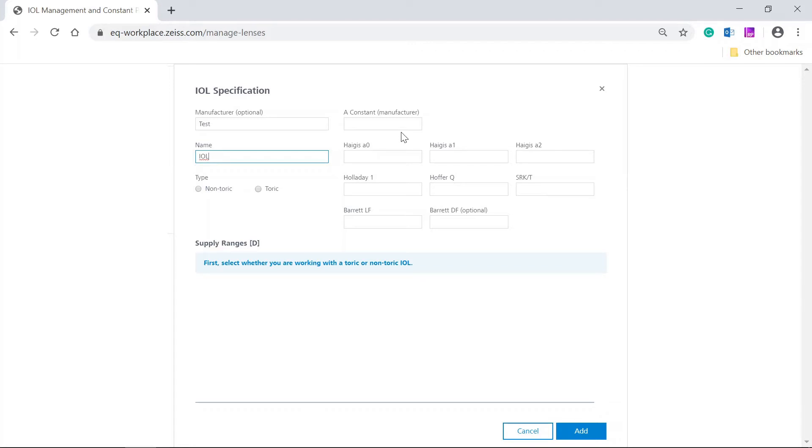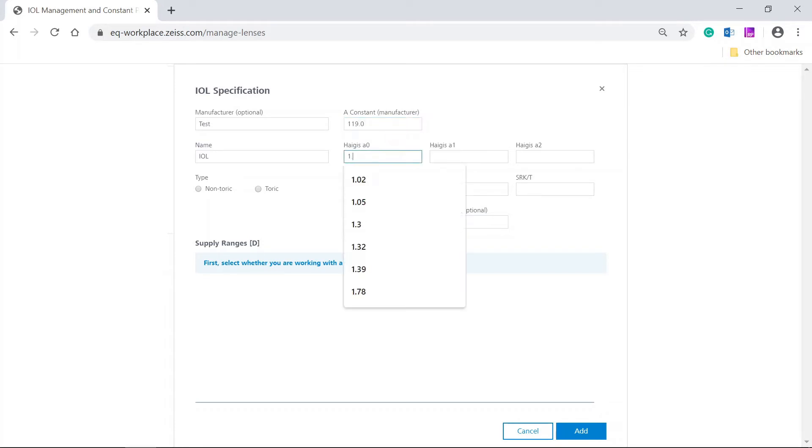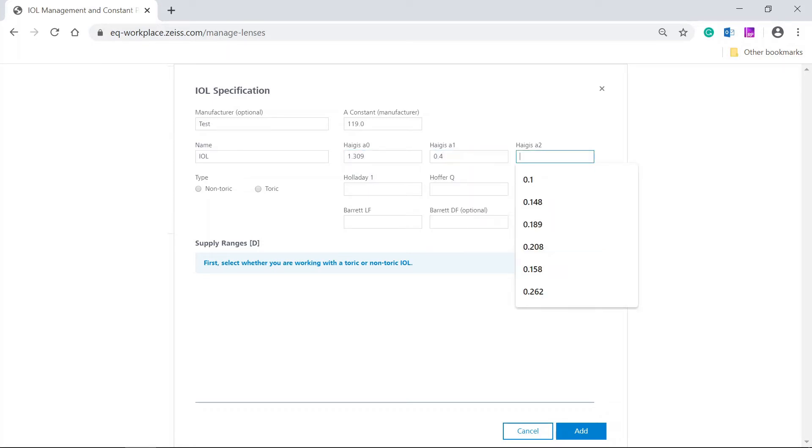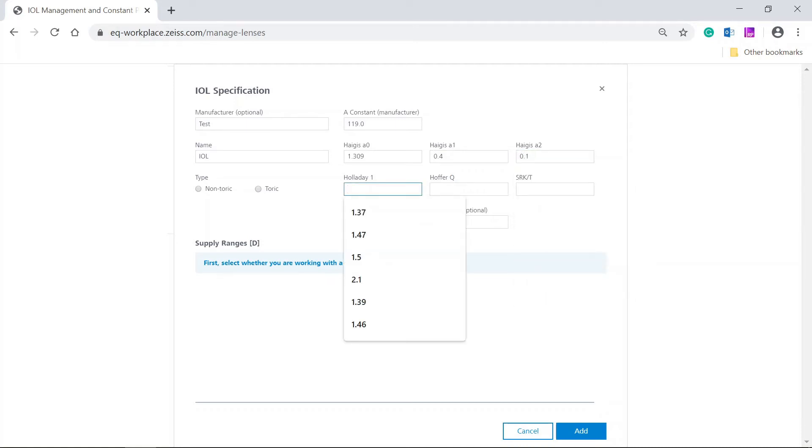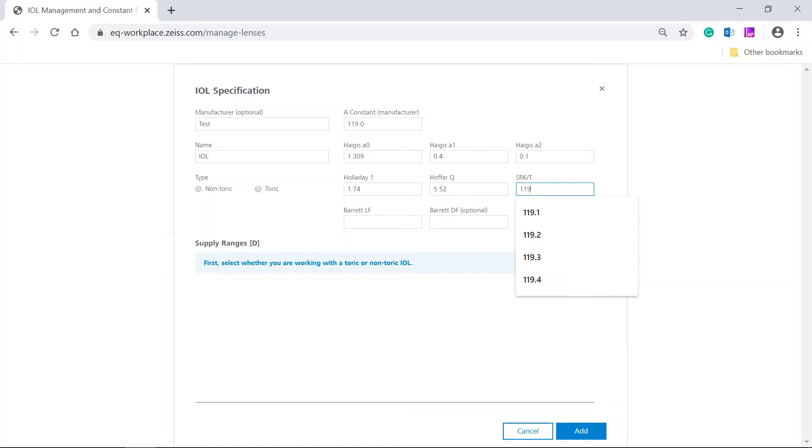A constant 119.0, A0 1.309, A1 0.4, A2 0.1, Holiday 1 1.74, Hoffer Q 5.52, SRKT 119.0.